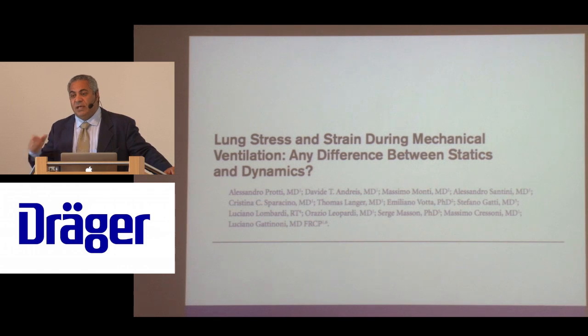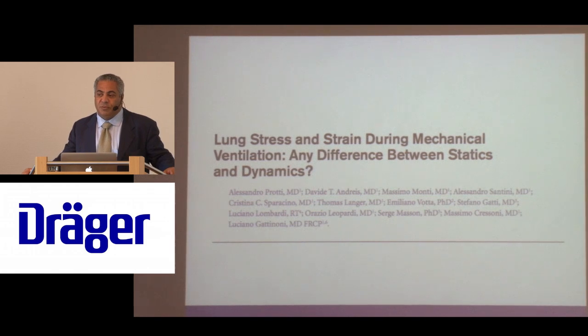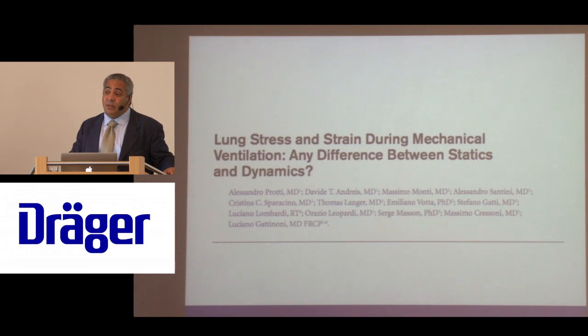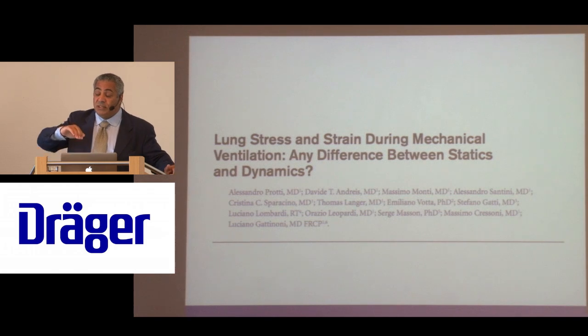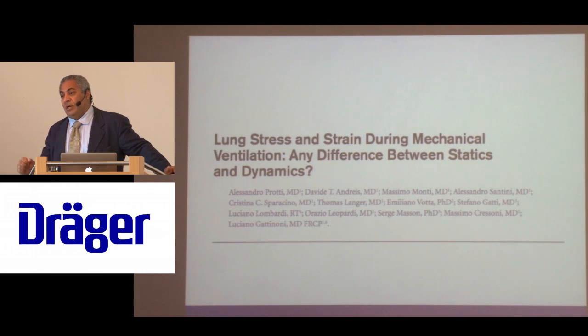And I have a colleague in the UK that's been doing more transpulmonary pressure measurements. We're going to be also showing some transpulmonary data. But the pressure in the stomach area, the gastric pressure, will go up. When they squeeze, their gastric pressure goes up. They let go, the gastric pressure drops, and then you get this. So we believe there's still diaphragmatic contractility. The older studies do suggest that that little boost occurs before the electrical contraction, but then the electrical contraction of the diaphragm continues and continues the breath.